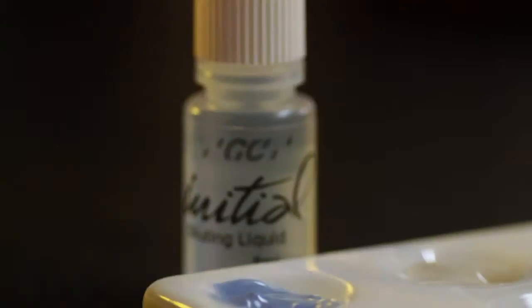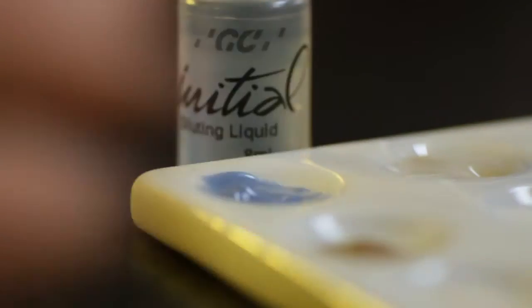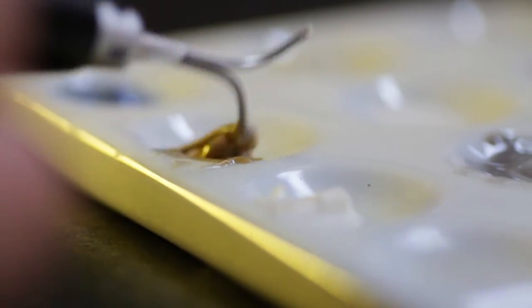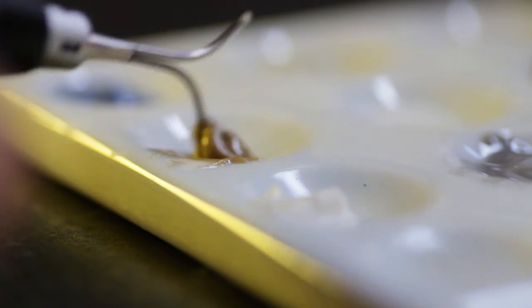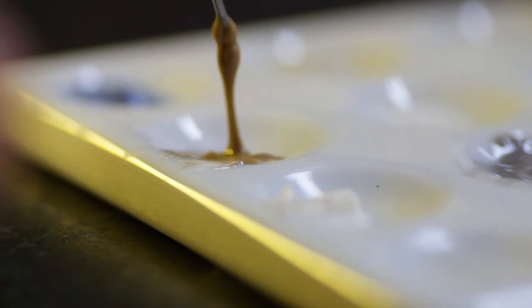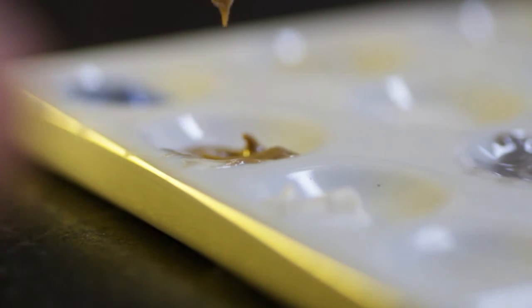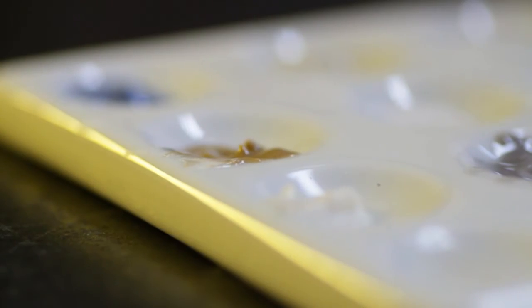Lustre Paste Diluting Liquid: the diluting liquid is a special liquid to offer the desired paste-like consistency for the application. However, it is recommended to obtain a gel paste-like consistency of the Lustre Paste for the best results. Note: if the Lustre Paste are diluted too much, the result is a reduction in the gloss after firing, and the desired result may not be achieved in one glaze firing. When needed, dilute the desired amounts of paste in a separate plate with diluting liquid — never dilute directly in the jars.